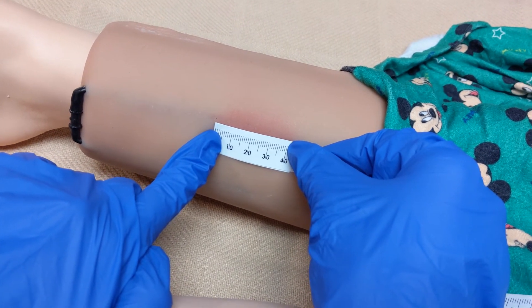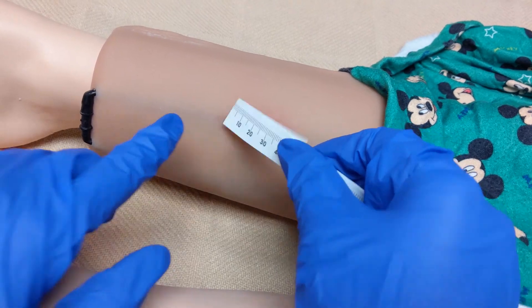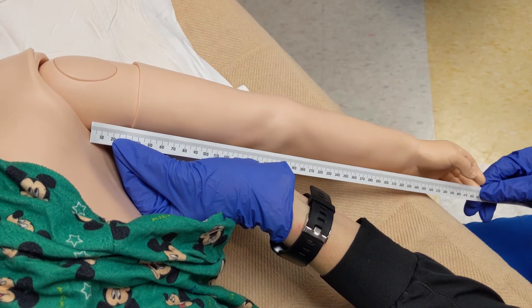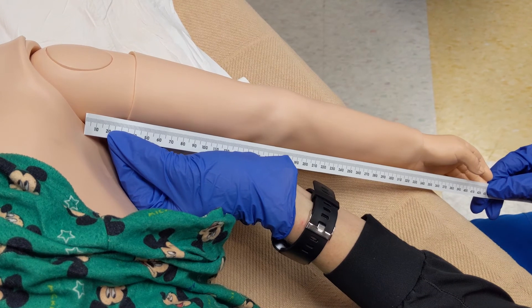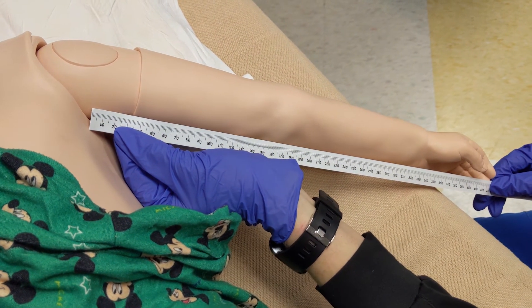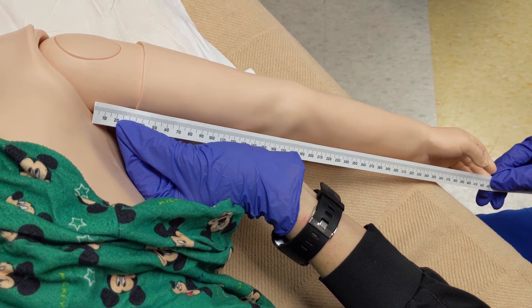Then I need to measure the length of my patient's arm. Regardless of where the infiltrate happens, you will always measure your patient's arm from their armpit all the way to the tip of their longest finger.